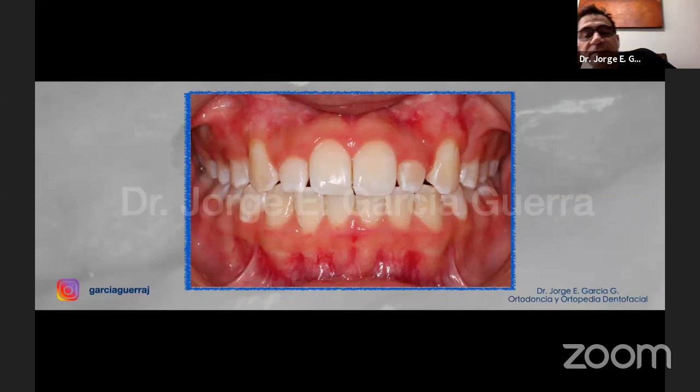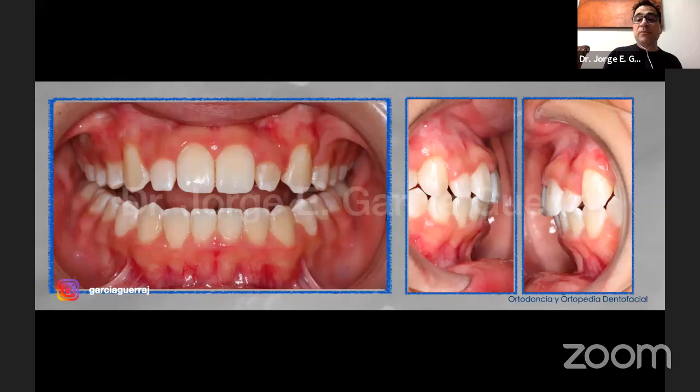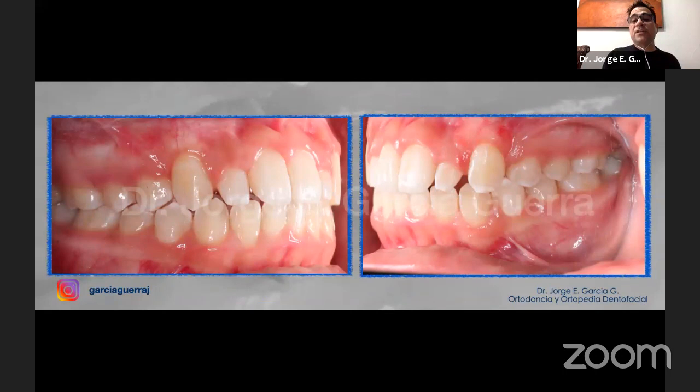I referred her to the doctor, and I also referred her for some aesthetic treatment of the lateral incisors, but she hasn't done that. She went to the periodontist, and I'm going to show you the pictures that she sent me. But we can see that it's a fairly well-finished case. We have our canines in great position. We have our lateral incisors there. We have a good occlusion.